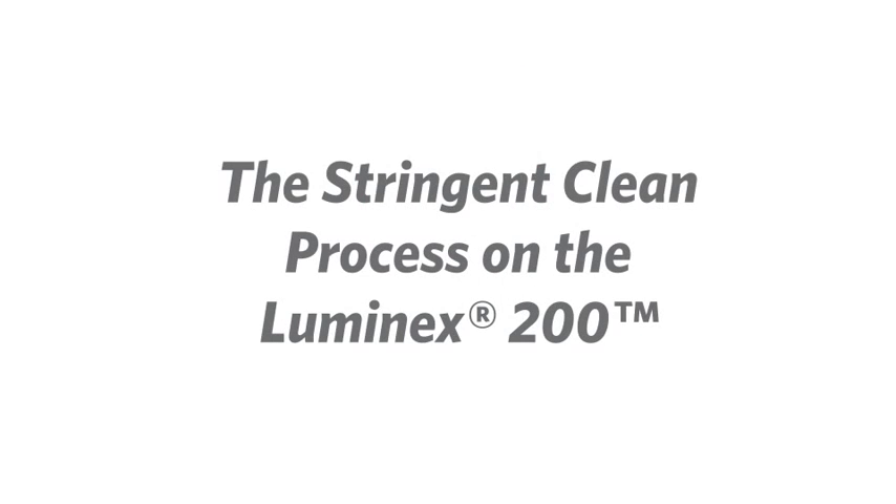Hi, my name is Linden. I'm a technical support agent here at Luminex. I want to go over how to do a process on the Luminex 200 instrument known as a stringent clean.